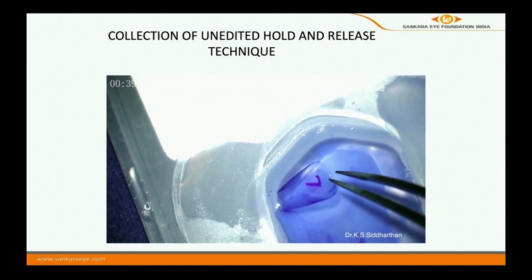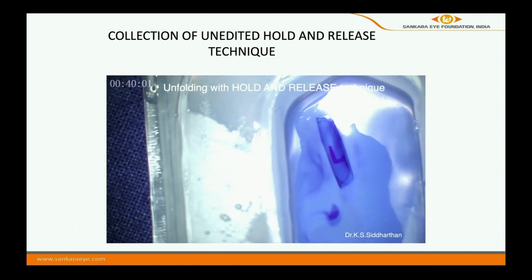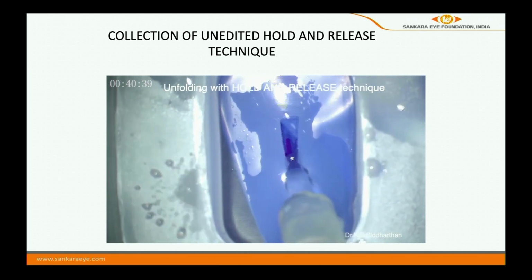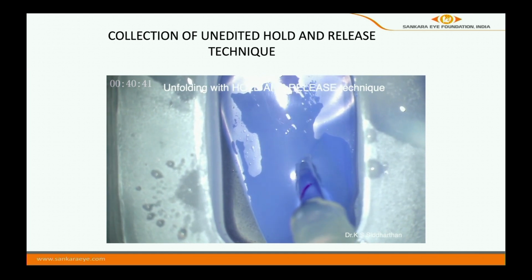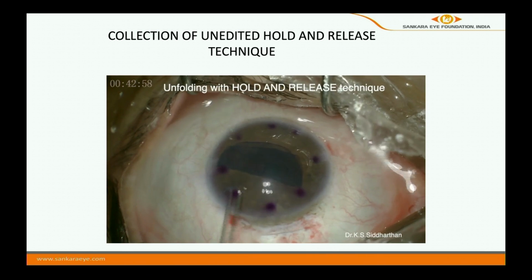Sometimes I don't really believe in positioning it in whichever position. I just don't do all these manipulations, because the more you touch, the more you pull, the more you do, all endothelial damage happens. So whichever position you want, it just goes in, and usually, as I told you, endothelium is always out unless you do a trifold and you do all these things.